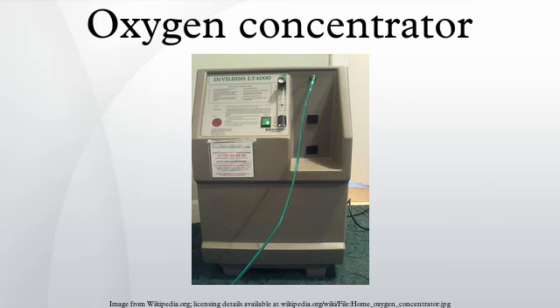Some larger portable oxygen concentrators are designed to operate in continuous flow mode in addition to pulse flow mode. Continuous flow mode is considered safe for night use when coupled with a CPAP machine. Common models retail at around $800. Leasing arrangements may be available through various medical supply companies and/or insurance agencies.